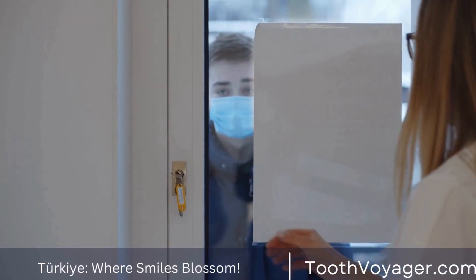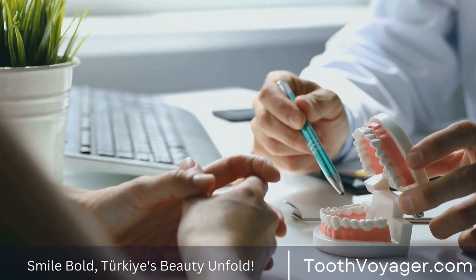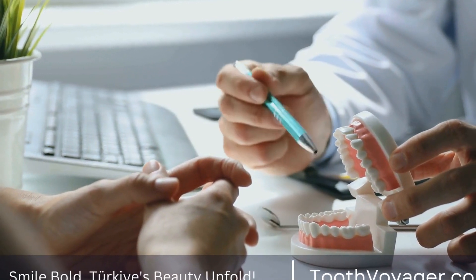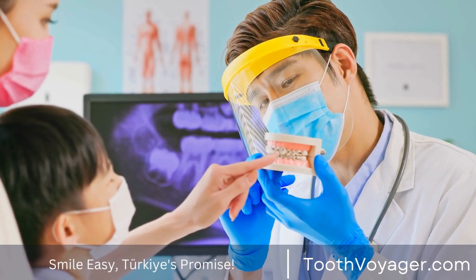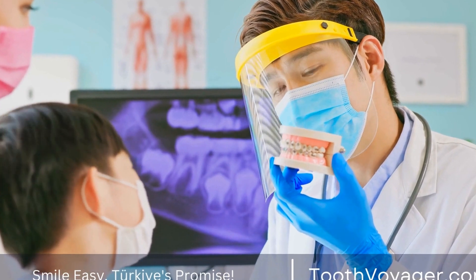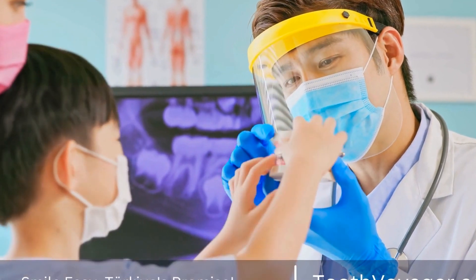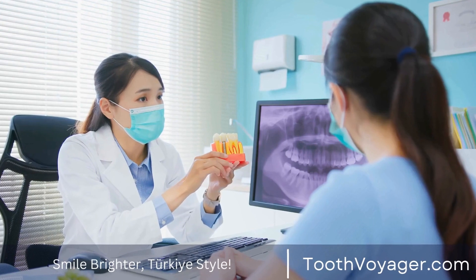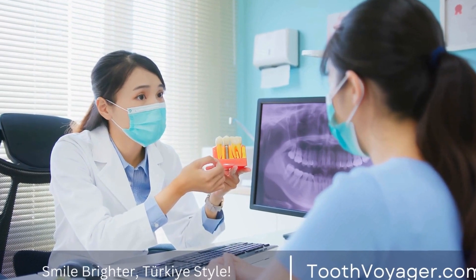Manufacturing and Fitting: Once the veneers have been crafted, they will be sent back to the dentist's office for fitting. During this appointment, the dentist will place the veneers on the teeth to ensure that they fit properly and match the patient's natural teeth. Any necessary adjustments will be made at this time.